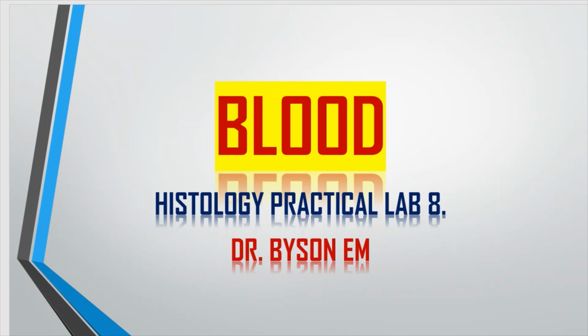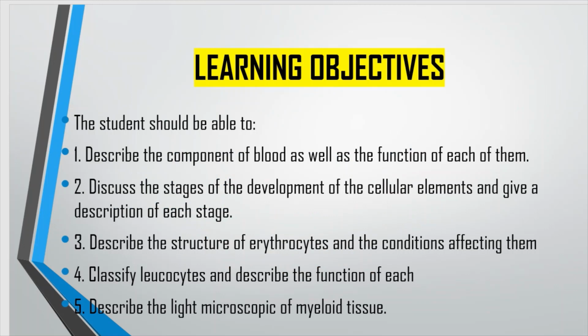Today we're looking at Histology Practical Lab number 8, which is blood. Without wasting time, let's get into this video. So we're going to look at the slides that we're supposed to do in histology.